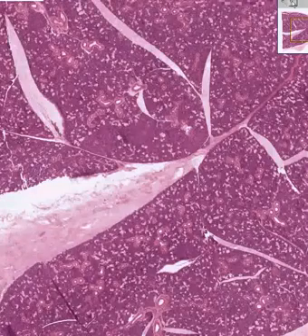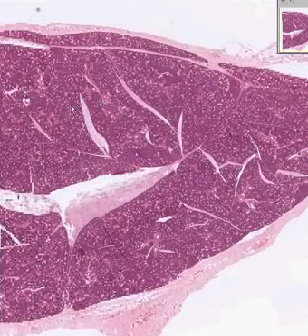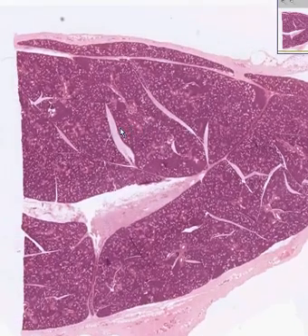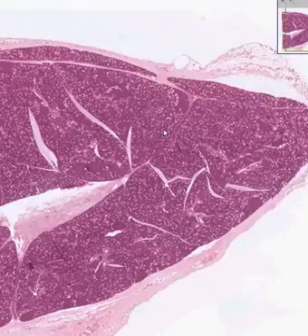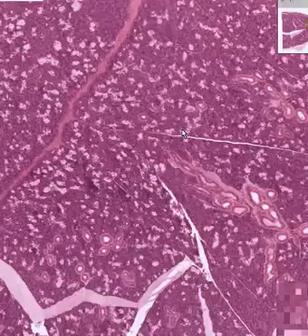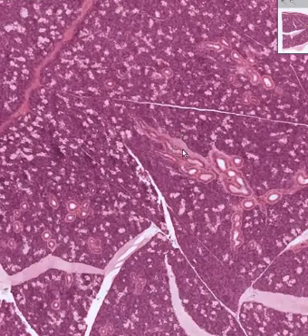Actually, I don't think we see any good ones. This might be a good shot at it right around here. Or maybe down here. Yeah, I think this might perhaps qualify as an interlobular duct if you truly believed that this fibrous connective tissue septum here was between lobules.